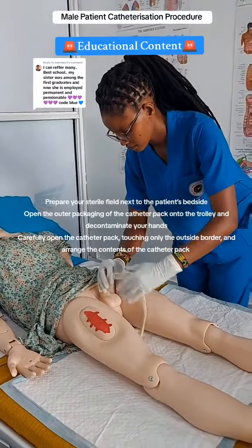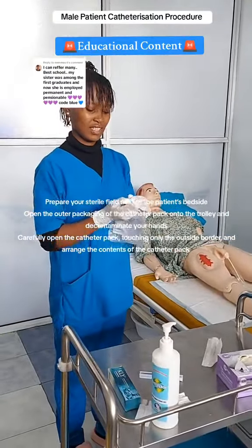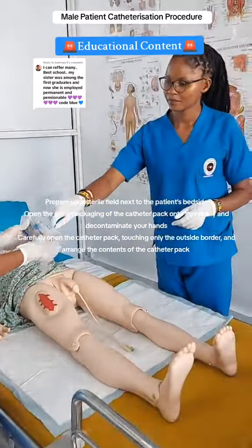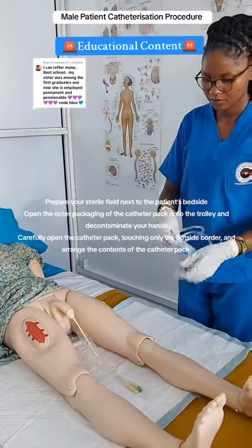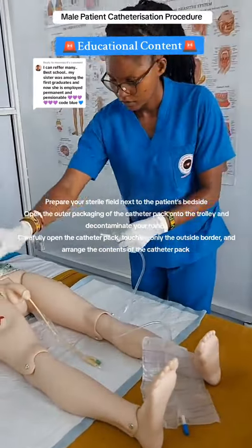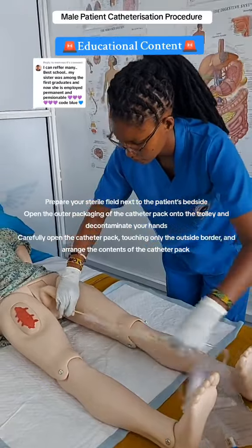Prepare your sterile field next to the patient's bedside. Open the outer packaging of the catheter pack onto the trolley and decontaminate your hands. Carefully open the catheter pack, touching only the outside border, and arrange the contents of the catheter pack.